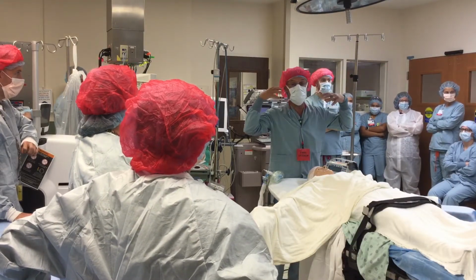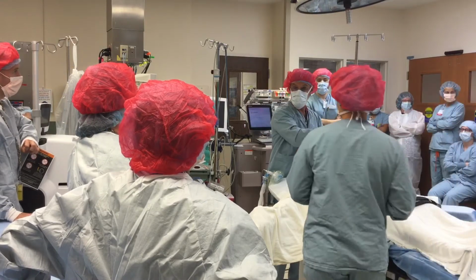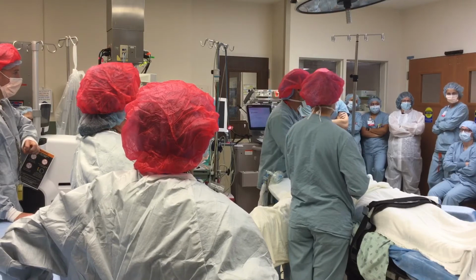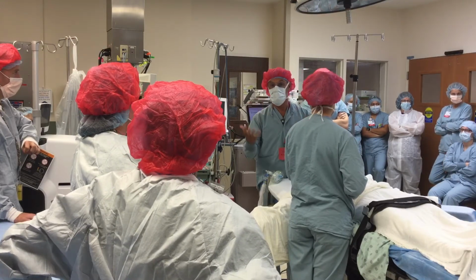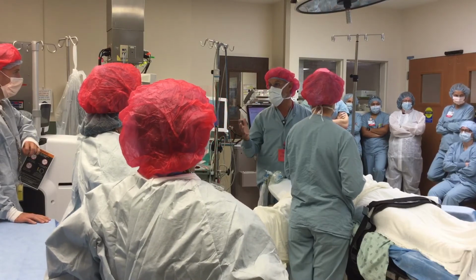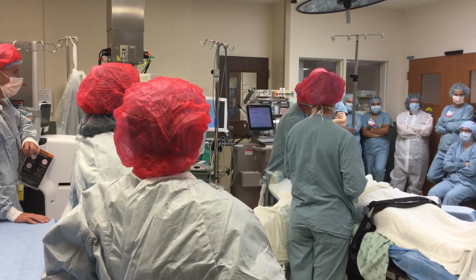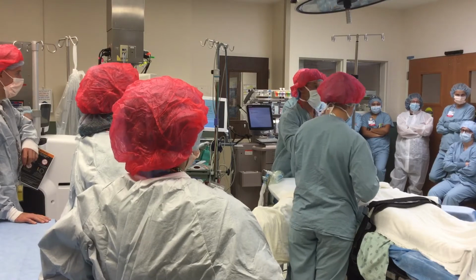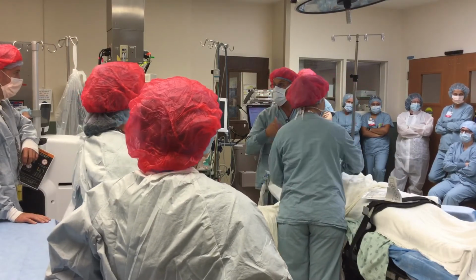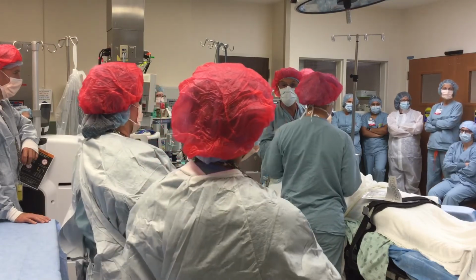Right away in our head, we know that this person fell, there's a long bone fracture, most likely we're dealing with fat embolus, based on the vital signs and everything, so we know probably what's going on. We're going to take care of the airway as you put pads on, which will give us two things: continued ECG and also the ability to shock, because we expect it.